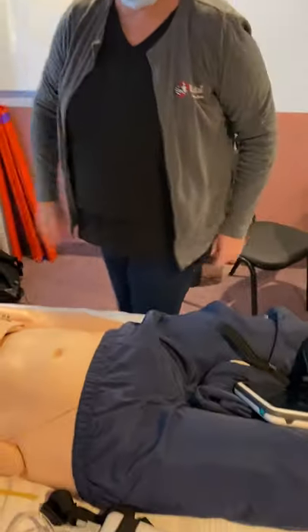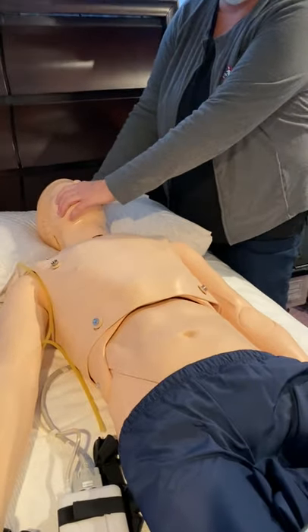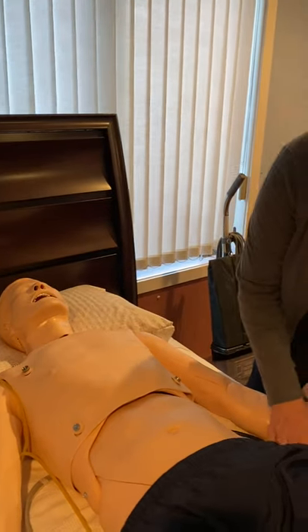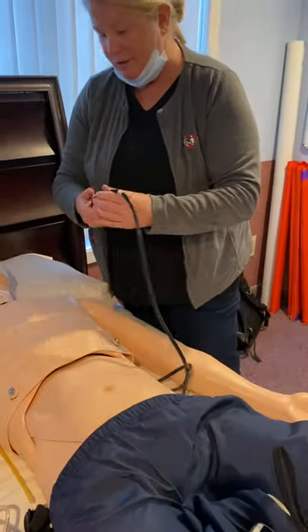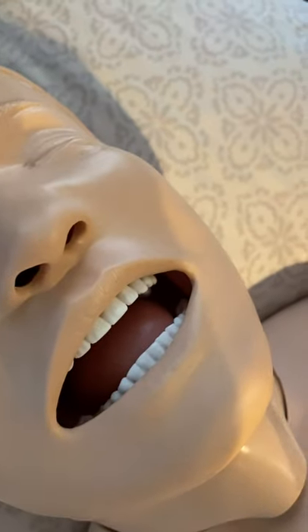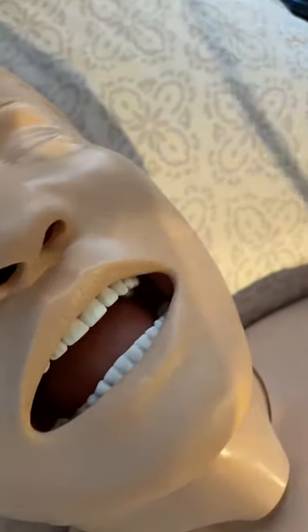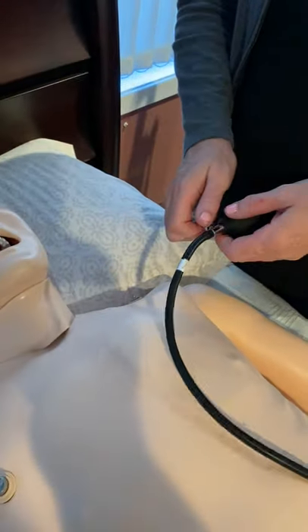Now let's quickly walk through the physical functionalities of the mannequin. You can intubate him — he is a fully intubatable mannequin. You can add a difficult intubation with this bulb, which gives you the ability to swell his tongue. If you pump this up, you'll see the tongue swell and you'll have a hard time getting in there. To release it, turn that down and the air will come out.